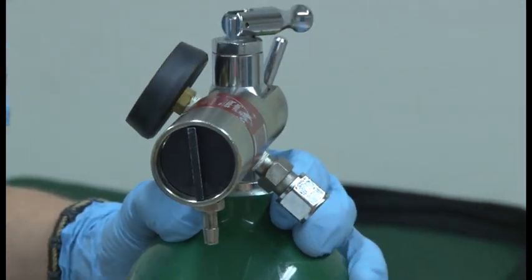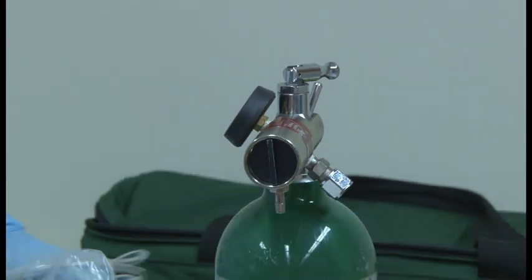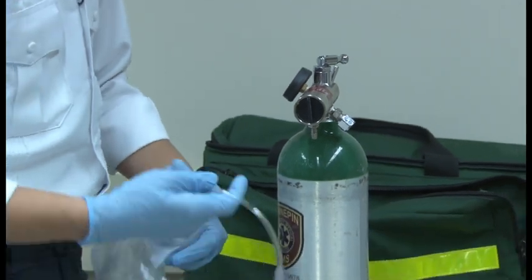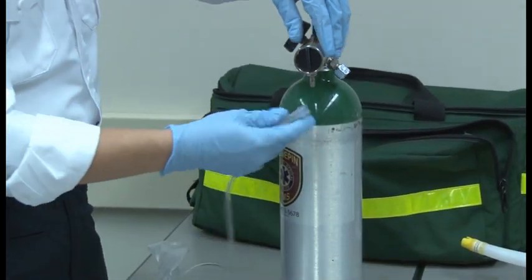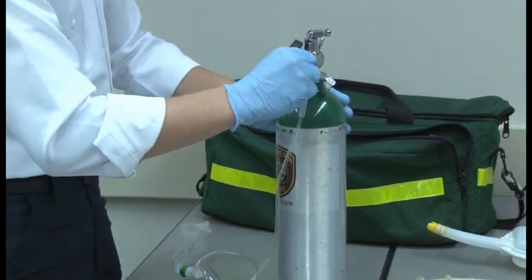Open it up. I'm going to check for the pressure and I'm going to listen for leaks. Next, I'm going to prepare the non-rebreather, attach it, and turn it up to at least 10 liters a minute.